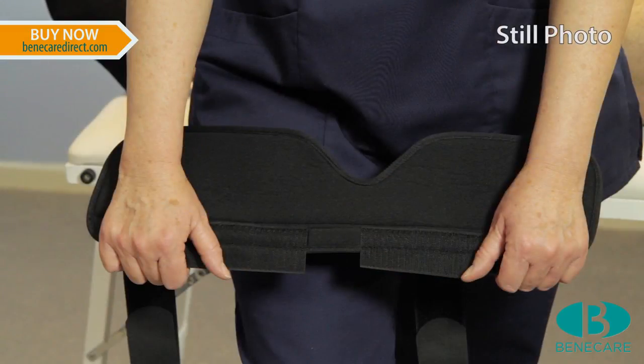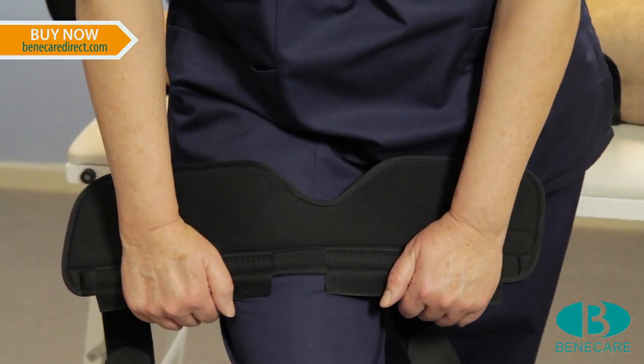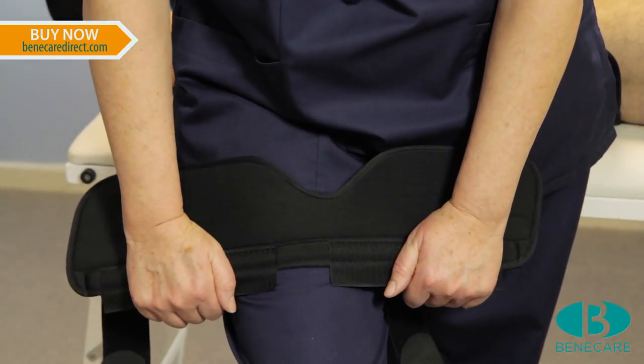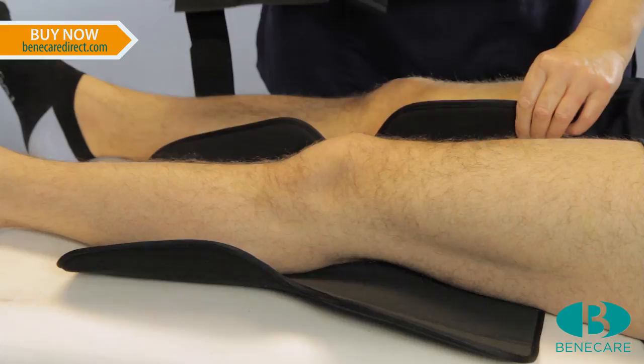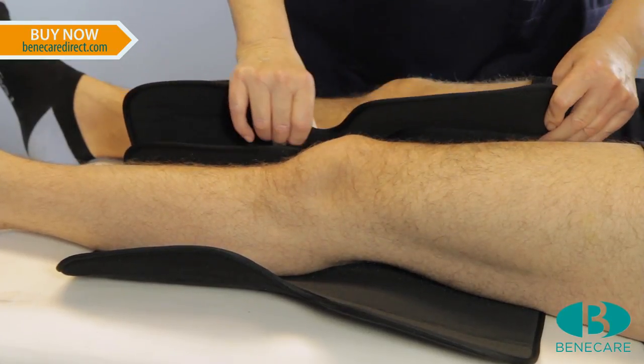Now check the staying — the medial and lateral components. These should follow the contour of the leg to ensure maximum stability is provided. If necessary, bend the stay to the appropriate shape and then secure to the posterior panel using the hook and loop fastening system.